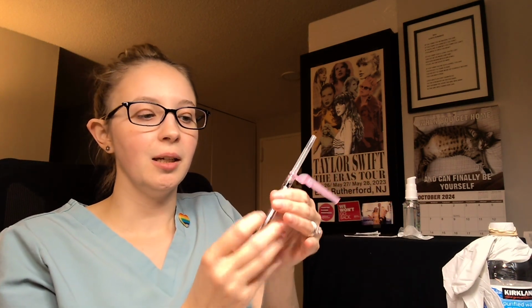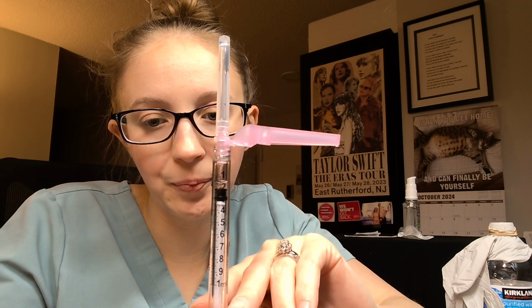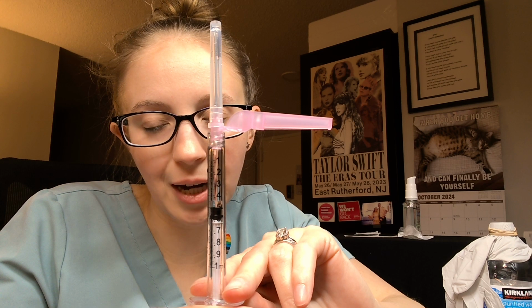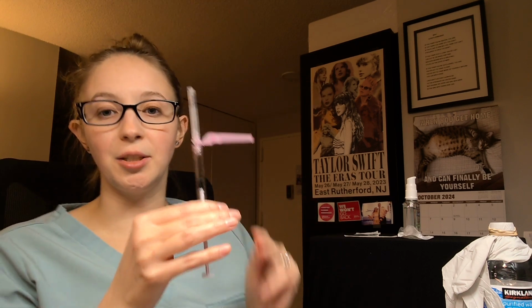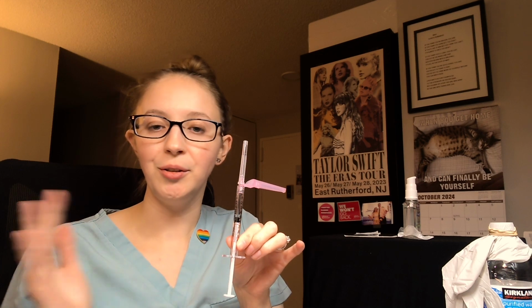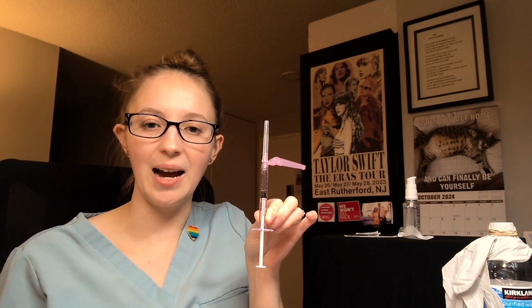Pro tip, before you actually pierce into your medication bottle, practice drawing up the amount that you need. So one of our examples was 0.5, so I would draw this amount of air up to 0.5. By doing this part first, when you pierce into the bottle, you push that air in and it makes it easier to pull the medicine out.